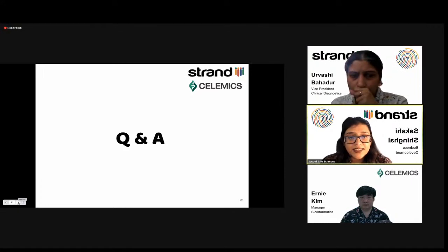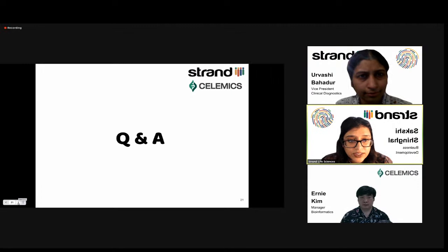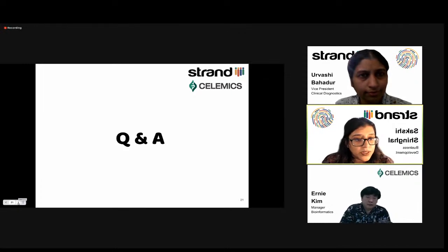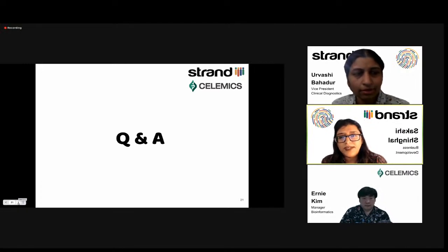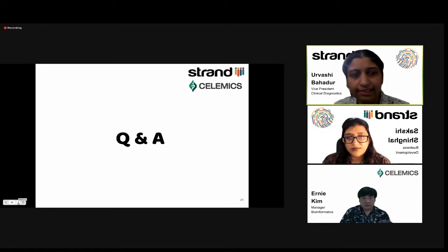So Violetta did respond. She said that her question is, what is the software used as an annotator to annotate or describe the variants that have been filtered as clinically significant? Some examples she gave were ANNOVAR, Variant Effect Predictor, and so on. Does that help a little bit? Right. So StrandOmics does that. I think we built our own. StrandOmics is the software which takes into account various databases plus a curated knowledge base, and then assigns this label. It's our own software that we use.